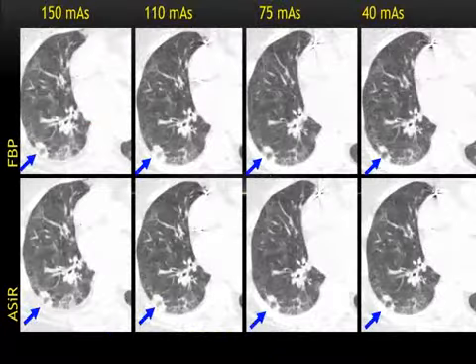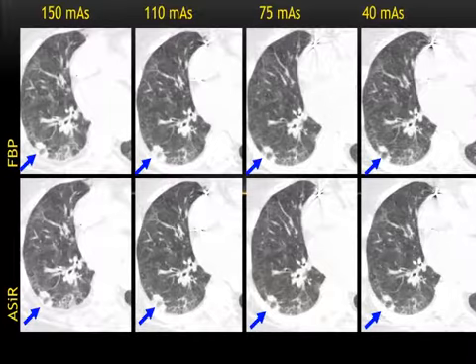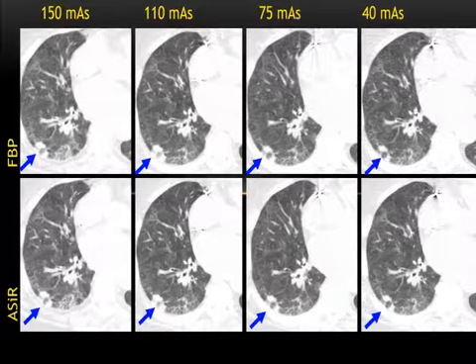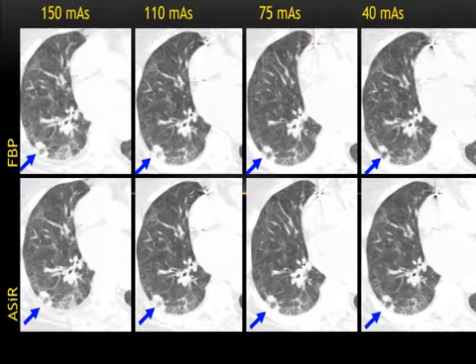Iterative reconstruction techniques, Sarabjit did a very good job in the morning to explain this, but basically, again, to make a point that in the lungs, noise doesn't really have much effect. You can go from a CTDI of about 10 down to 2.5. You can still see all the abnormalities that you want to see. And although the ASIR does denoise, and so do the other iterative reconstruction techniques, really, this is as acceptable to me as this is. So in the lungs, iterative reconstruction techniques, unless you're talking about really low doses, under 1 milligray, are not going to have that much of an effect.